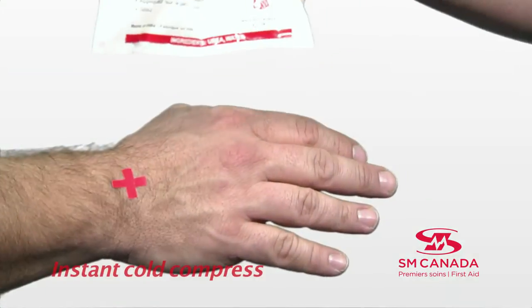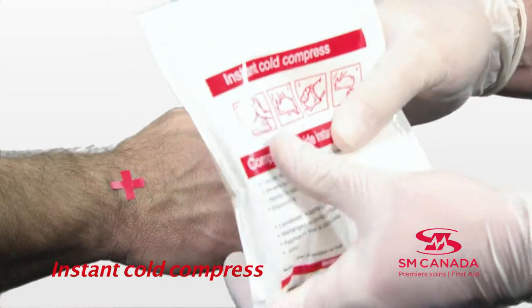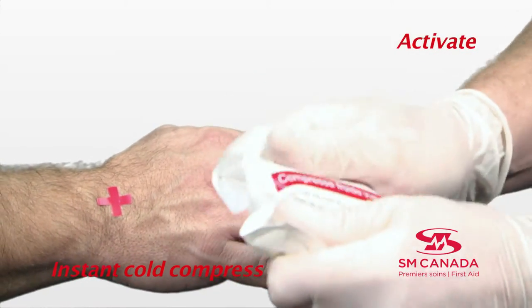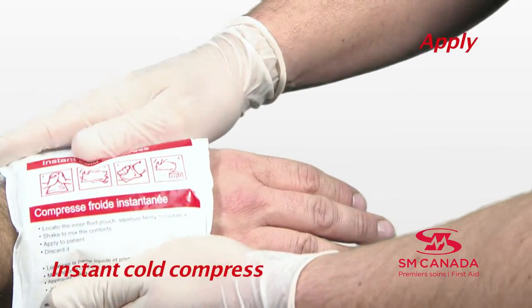In an emergency situation, never apply heat — always apply cold. For this purpose, you can use an instant cold compress. To activate the compress, hit it and mix it together, then apply it directly to the wound.